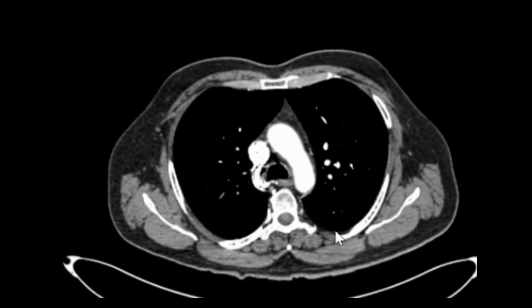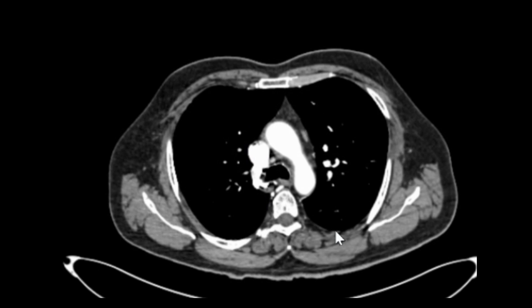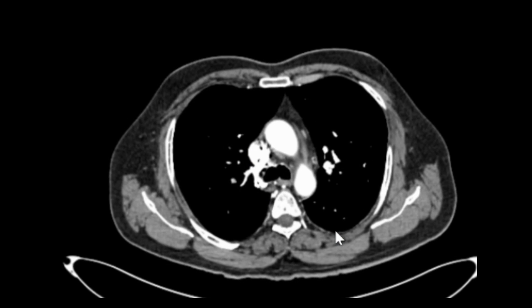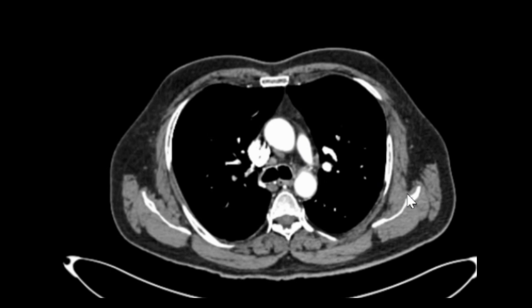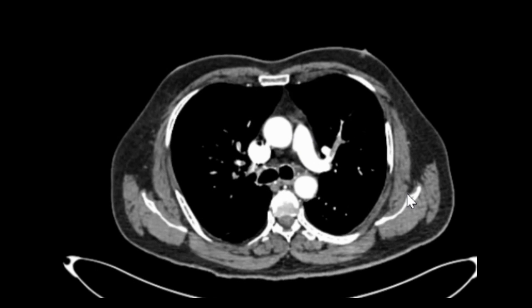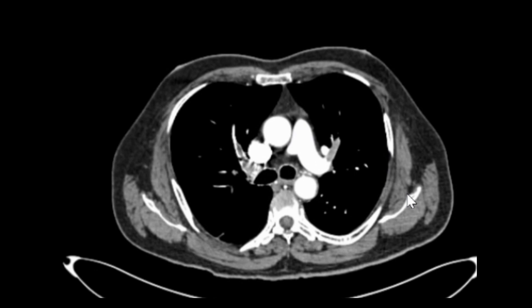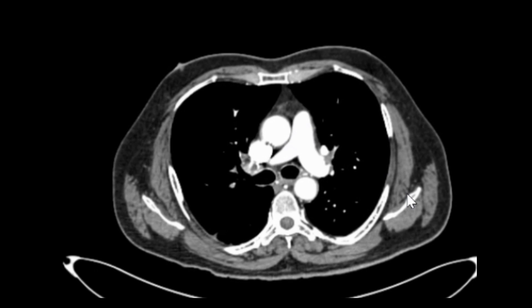As we move down, we can see the ascending aorta, descending aorta, and the pulmonary vessels start appearing.